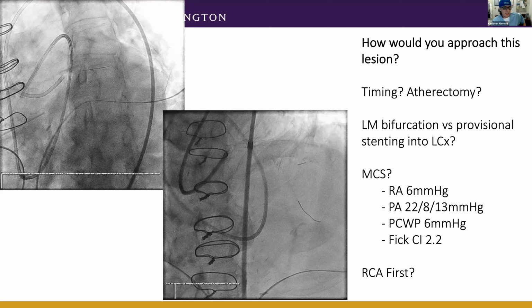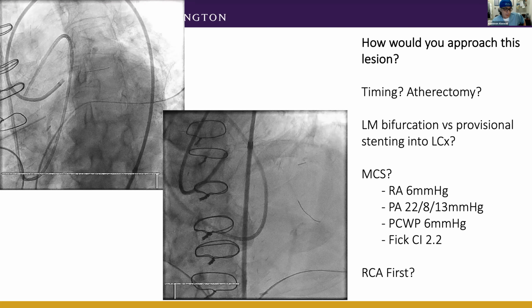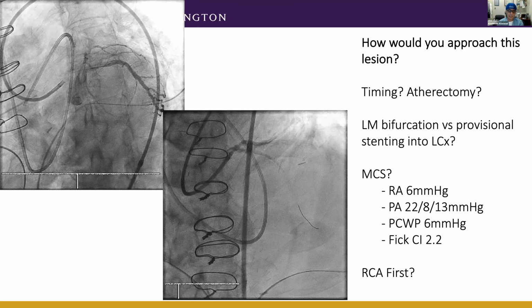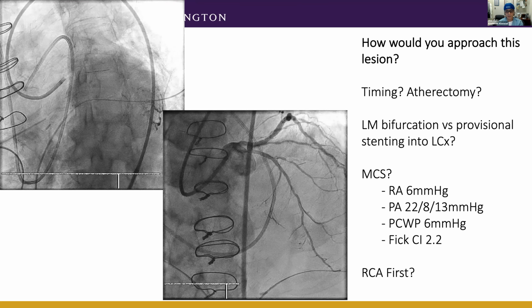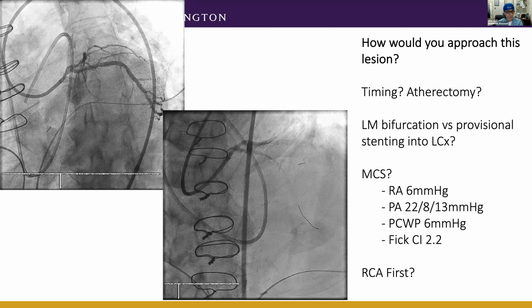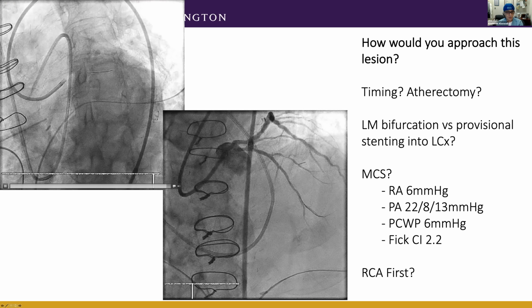In a calcified vessel, God forbid you get a perforation, you need access for another wire, another balloon, and you can deliver a covered stent with another. So I don't think, in this day and age, with PCI now done for extremely high risk procedures and high risk lesions, as opposed to what we did until recently. We did type A and B lesions, the low risk lesions, that actually have no benefit, until we found out there is no benefit from opening these lesions versus medical therapy. We never had a trial where we tested all these lesions. These are complex by definition, 79 years old. So you better be prepared.